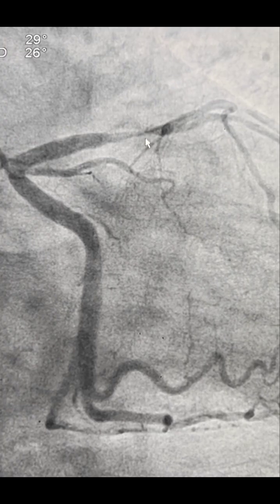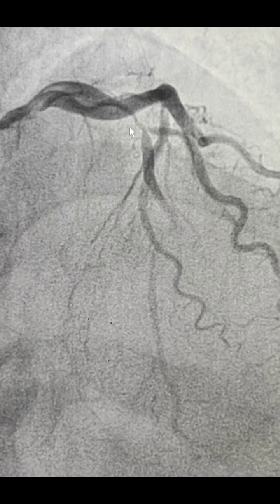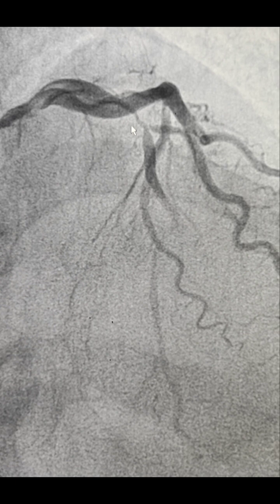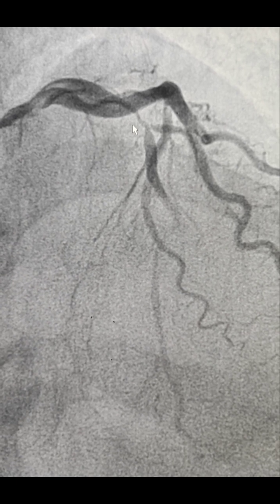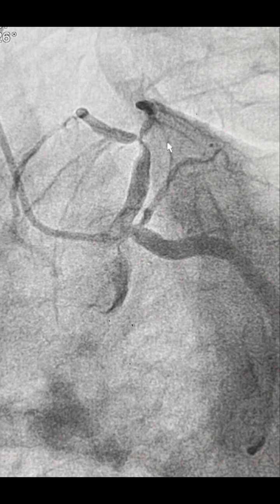There's again the RAO caudal view. You can see clearly in this cranial still frame, near the arrow there is a subtotal occlusion in the LAD. So my plan was to put one wire in the diagonal and one wire in the LAD with an XB 3.0 catheter.